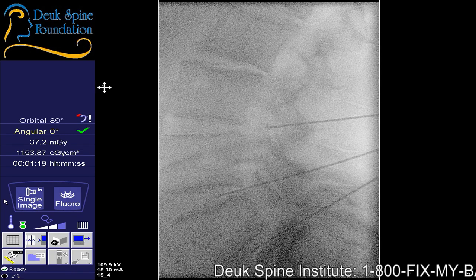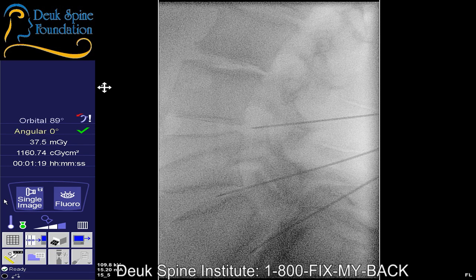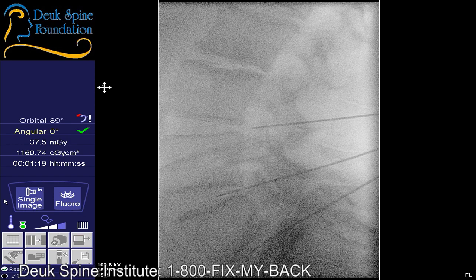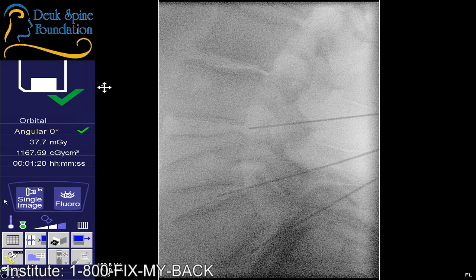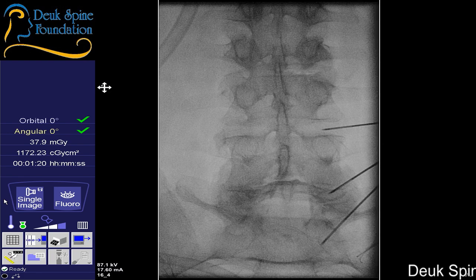We're entering the L3-4 foramen. I can feel the foraminal ligament. I can feel your herniation. AP, yeah. I can feel the herniation there in the foramen. Wow, look at that L5-S1, how steep it is. It's perfect. All right, go back to a lateral.